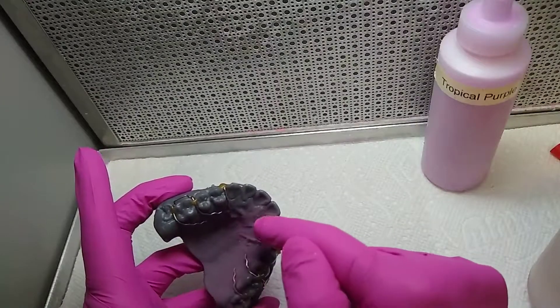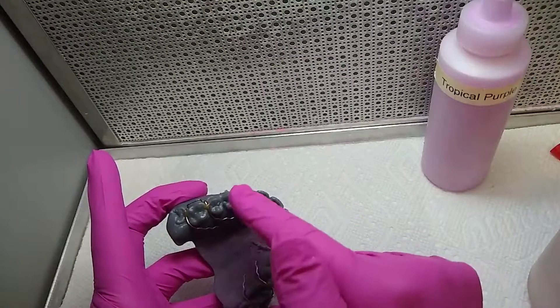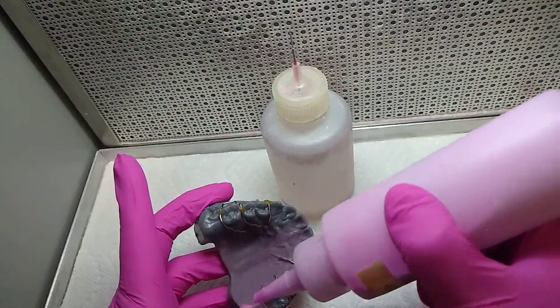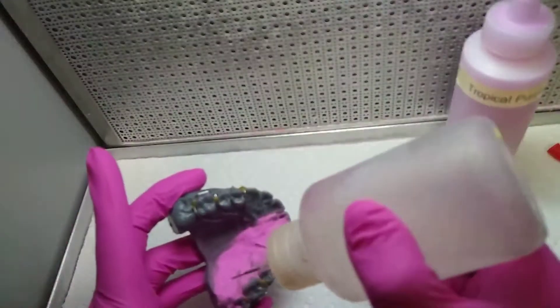There are two methods to pour acrylic. The first one, you can pour the posterior quadrant, then the anterior and the other side. Or you can pour half and half. I usually do one half.